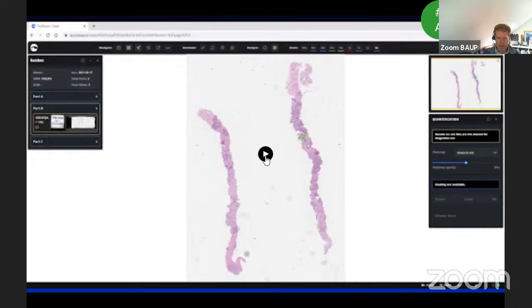Interesting, someone said that if you gave a diagnosis of high-grade PIN on the last case, that would result in a discharge from care. I'm not sure that is totally the policy everywhere. It should provide awareness of PIN, but not be of much concern. I'm not quite sure about the last one.